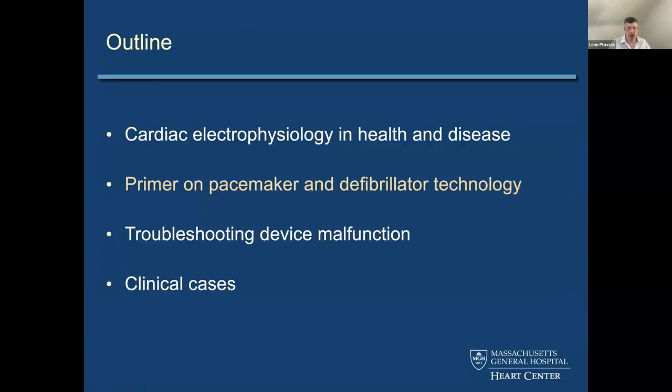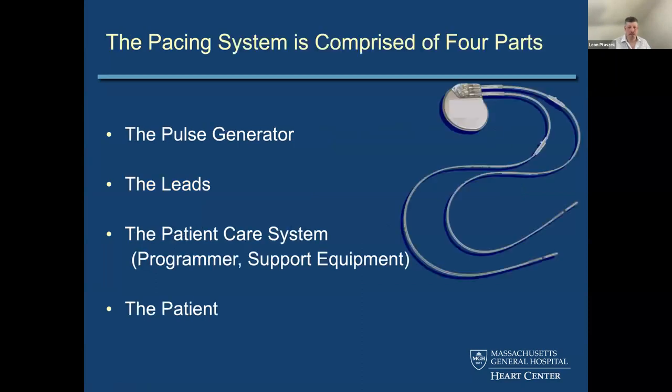So enough about cardiac electrophysiology and health and disease. I wanted to get into a brief primer on pacemaker and defibrillator technology for just a few minutes. As you very well know, the basic pacing system is comprised of 4 basic parts. There's the pulse generator, which contains the computing system and the system for pacing and sensing, as well as the battery. And then there's the leads, which attach the pulse generator to the heart.